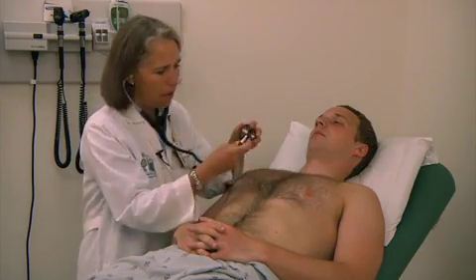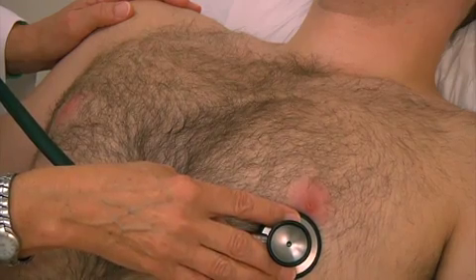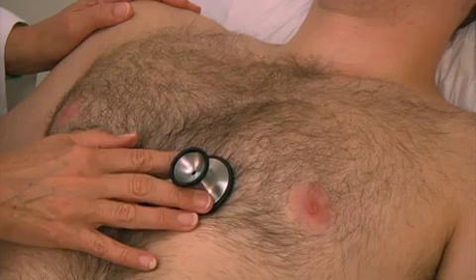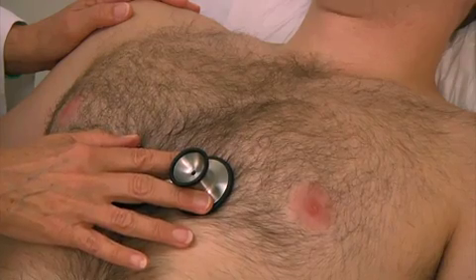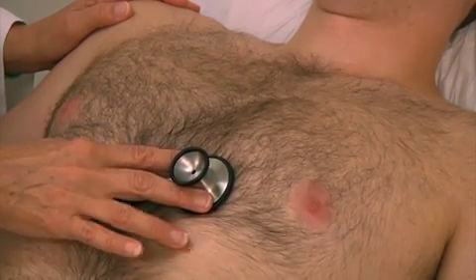So I would typically listen with the diaphragm at the mitral area, a couple of cardiac cycles. Now I'm listening at the tricuspid area, and the diaphragm is firmly placed on the chest, not hard, but firm, so it's not sliding around.